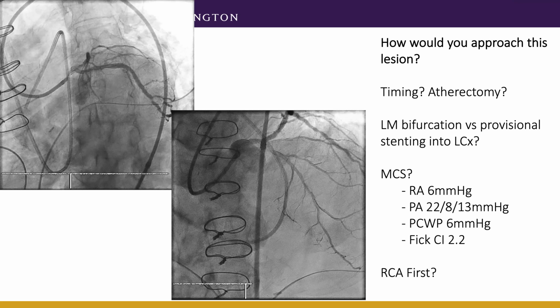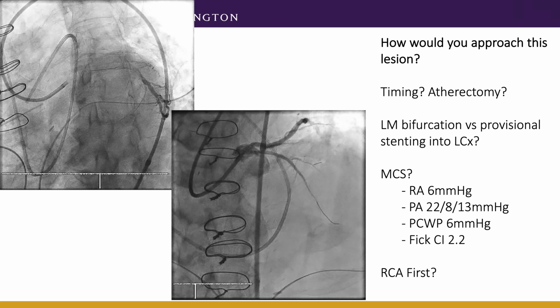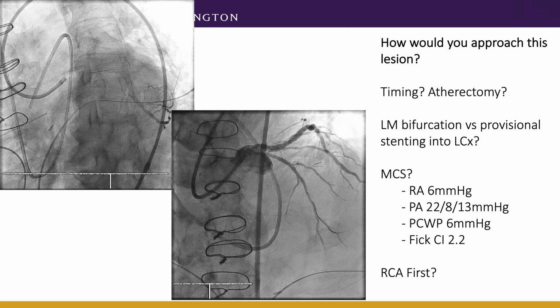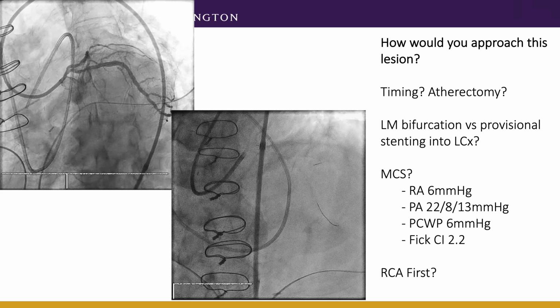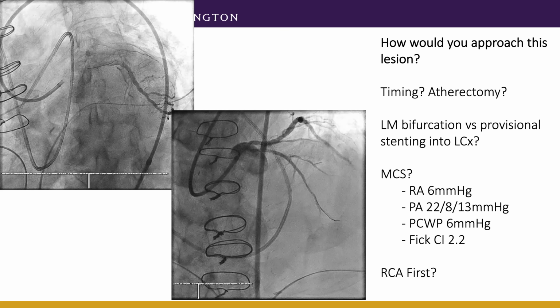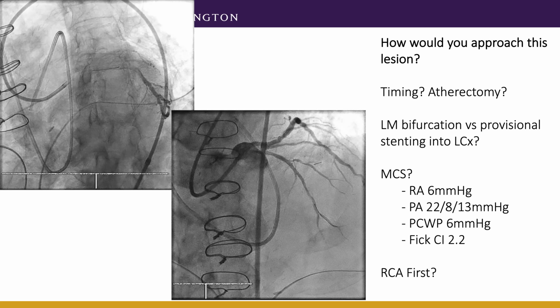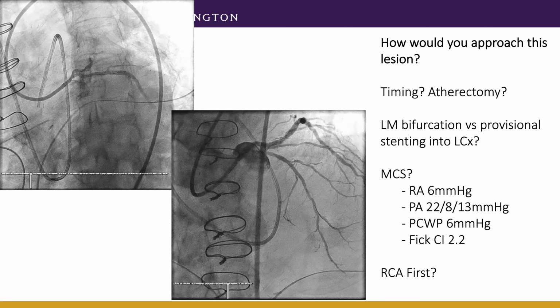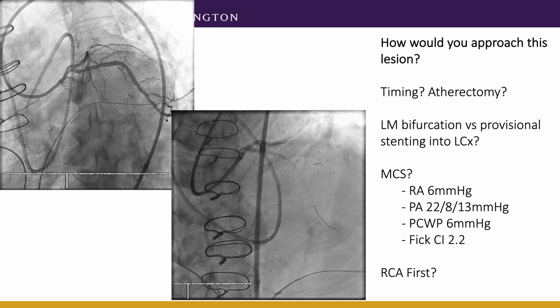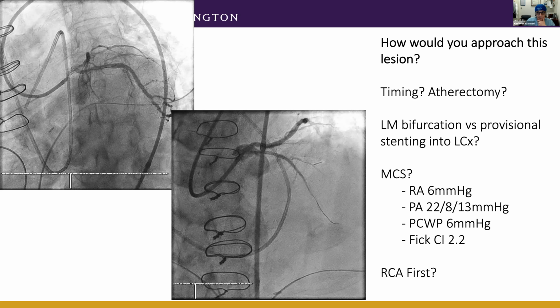I think they gave me the power to unmute, so I'll jump in and say I agree. For us it's twofold. For bleeding avoidance strategies, radial would make sense, but they had some difficulties anyway. And efficiency was really important to us, because the thing I was most concerned about was riding his heparin at a level that we can get through the case and get him through this so he can move in bed without having angina on a high dose nitro drip, but not start dumping into his chest tubes again, given all of those issues. Weighing all of that, our complication rate is so low because all the fellows are as neurotic as Cal and I are about access, and learned how to do it that way, that we're pretty comfortable with that. So if we think it's going to give a clear advantage, we'll go for it. Perfect.